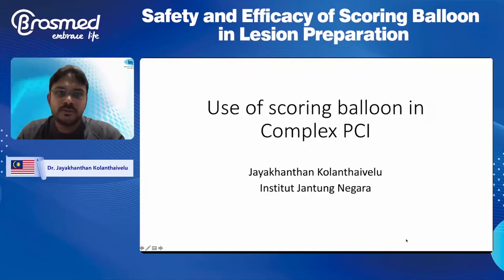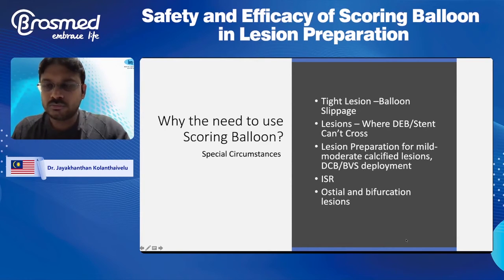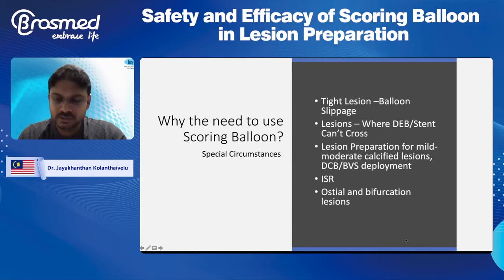Let's talk a little bit about the use of scoring balloons in complex PCI. Why the need for scoring balloons? Why are the usual balloons that we've had in the past not good enough? I think tight lesions, very tandem lesions, spot lesions. A lot of times, especially if it's fibrous or calcified, balloons tend to slip a lot. So a scoring balloon gives you a little bit more control and reduces balloon slippage.